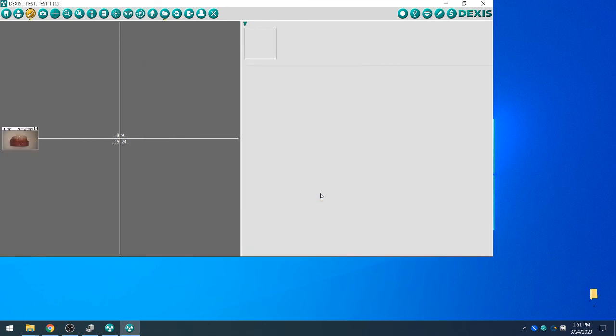This concludes the installation process for the Iris X80 into DEXIS 10. Once again, thank you for choosing DigitalDoc for your intra-oral camera needs and have a great day.